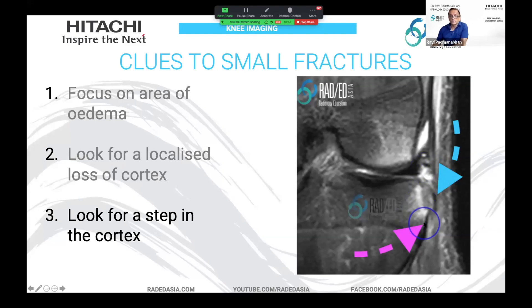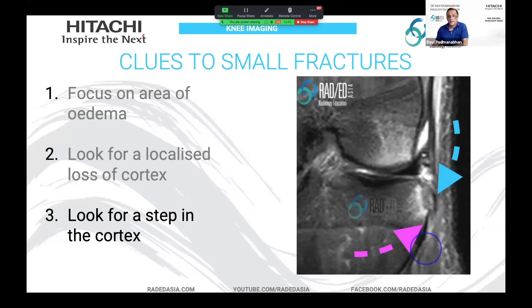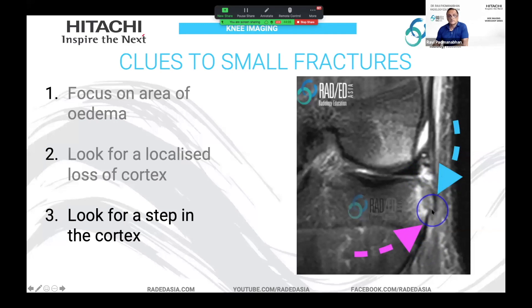Another thing to look at is a step in the cortex. This is where the fracture fragment has been slightly displaced from the parent bone. The pink arrow points to the normal cortex. Here's the cortical line above, and then you see that they don't match — there's a gap between the two of them.